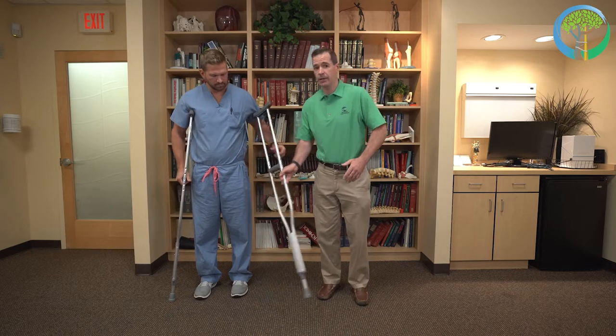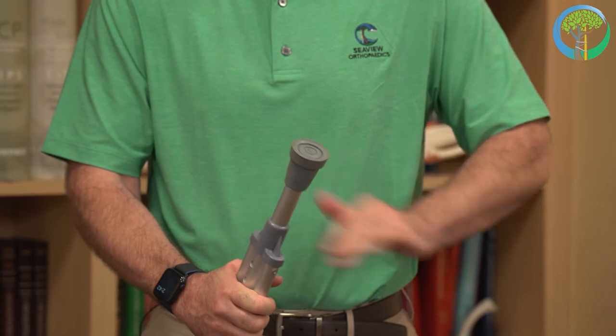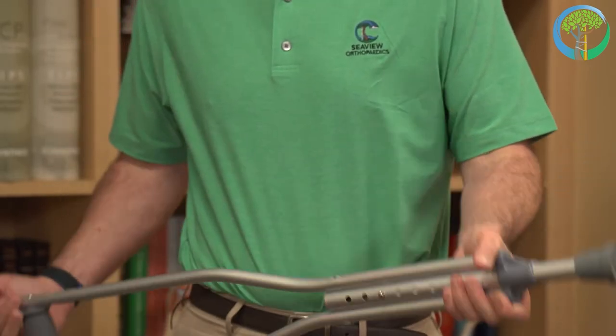Keep in mind, you need to check the bottom of your crutches periodically at this rubber stopper. Make sure this remains intact. If it begins to wear, it needs to be replaced because it could lead to the crutch being slick and easily sliding off of other surfaces.